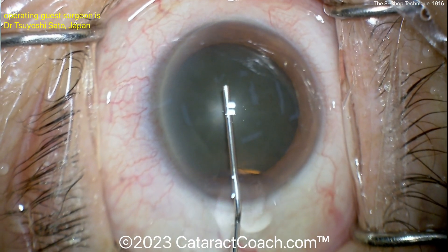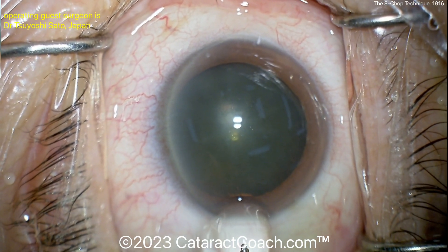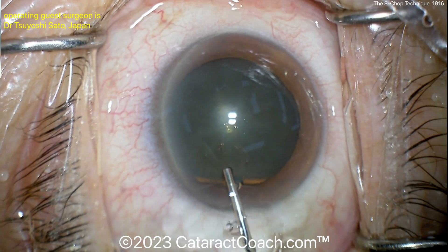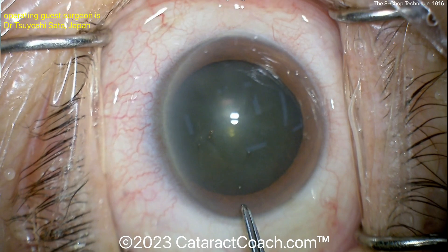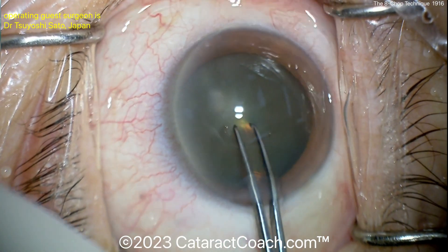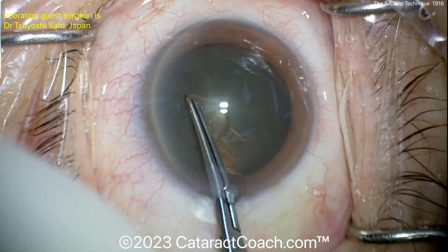Viscoelastic is being placed — this looks like it could be a soft shell technique with a little extra squirt. Then the forceps come in, and there's a nice tear-down to begin the capsulorhexis, something you may not have seen before.